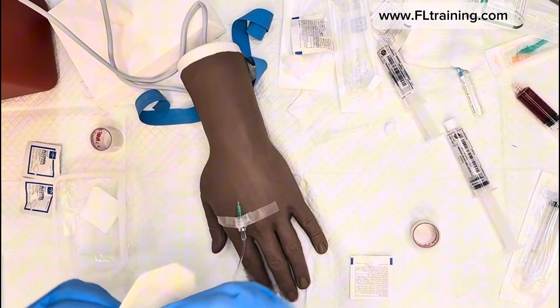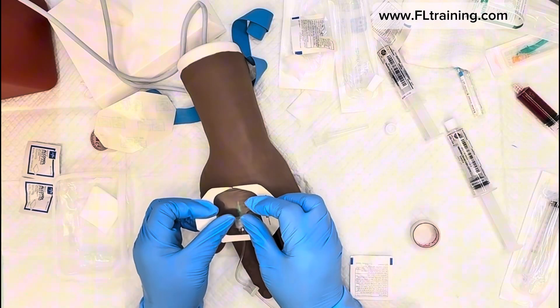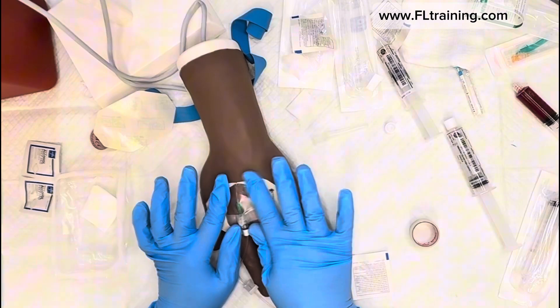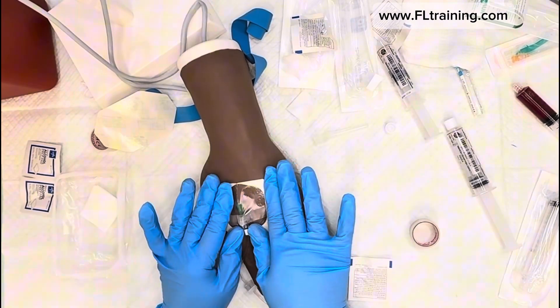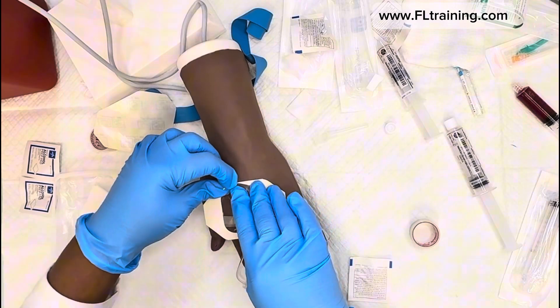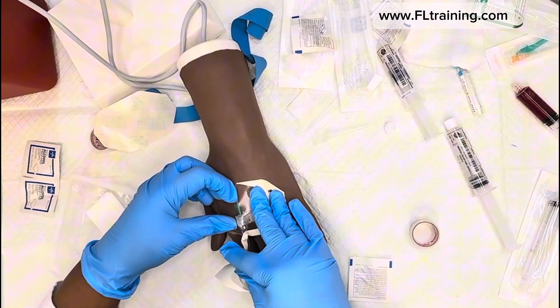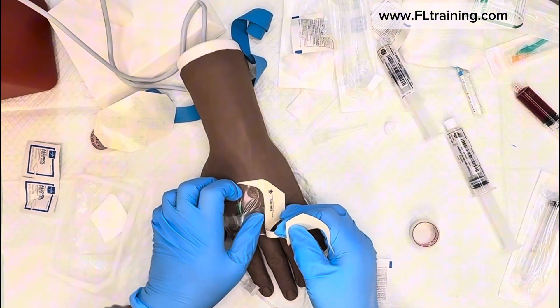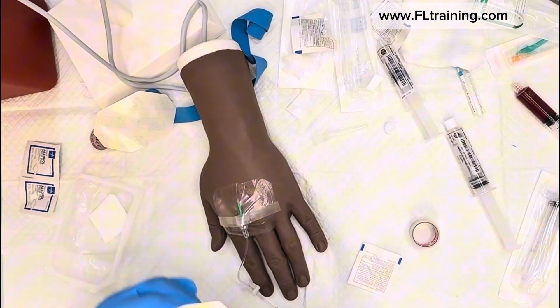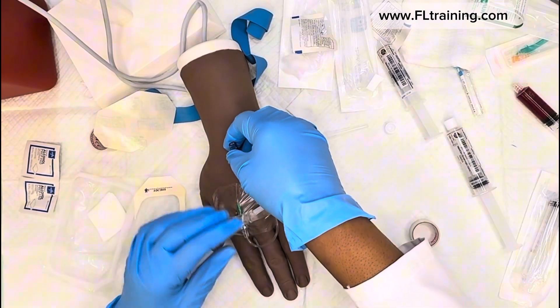Now that we have our catheter taped, we're going to use our transparent dressing. The transparent dressing not only protects the IV site but allows you to look in and monitor it. If you see anything abnormal, stop whatever transfusion is going and notify the physician — you may need a new IV line.